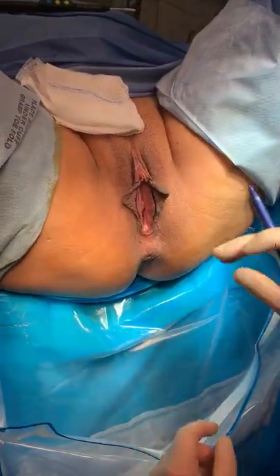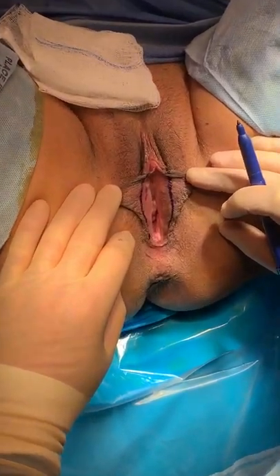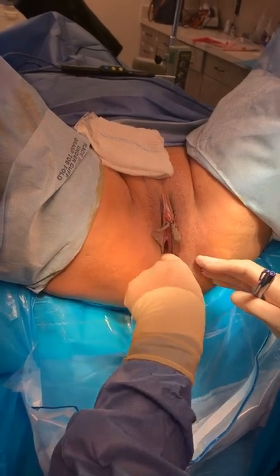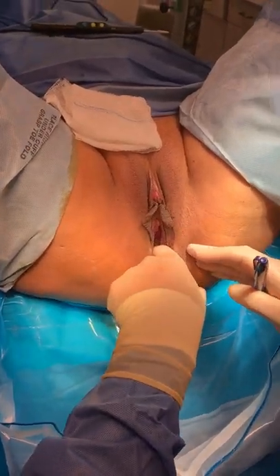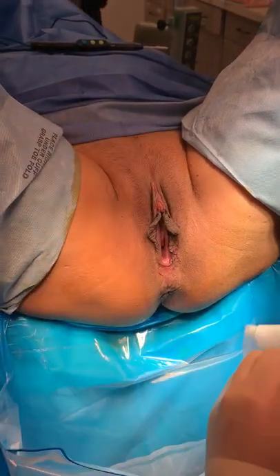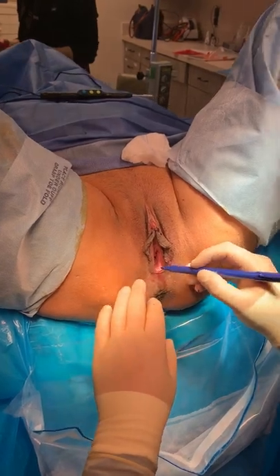So there are our main lines for labiaplasty minora — pretty symmetrical, pretty simple. And then for my vaginal tightening procedure, I really want to gauge, one, how tight the patient wants to be and what I'm dealing with. She doesn't want me to overly tighten her, so I'm going to be pretty conservative and stay about that.